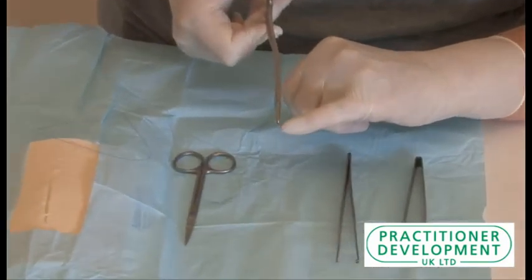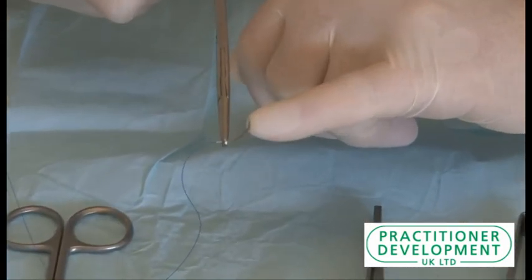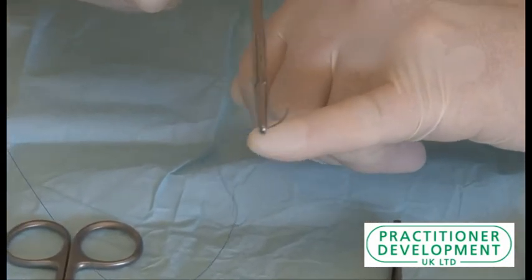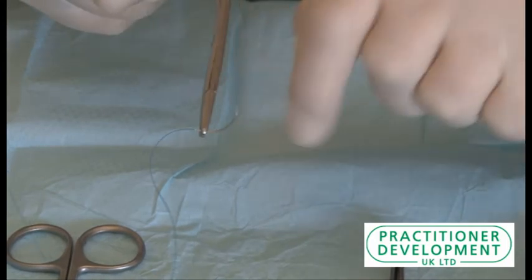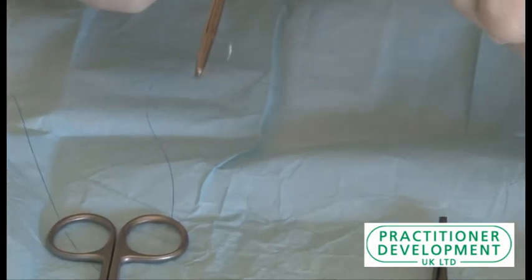So it should be at a 45 degree angle, near to the very end and near to the end of the actual needle itself, but not right on the join where the thread comes up because this is quite a weak area.